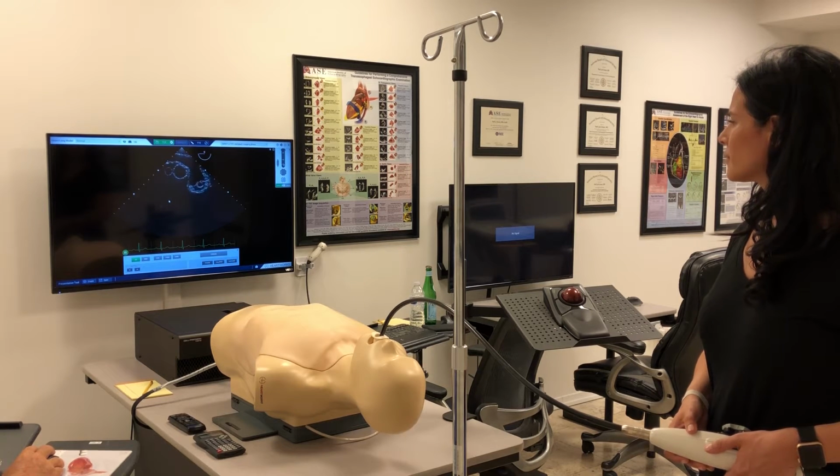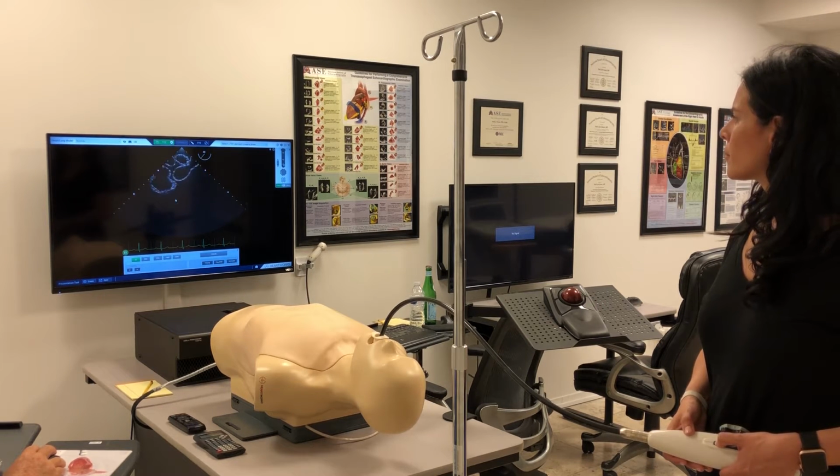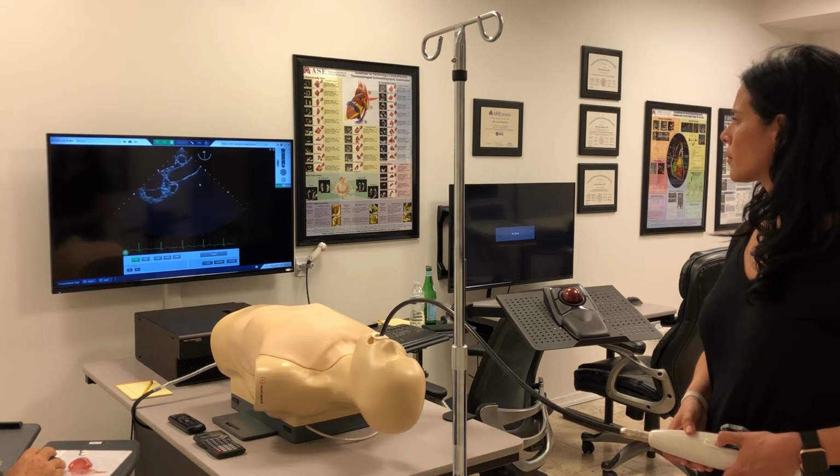Now, the next view is simply this view in long axis. If you've obtained the short axis view at zero, you know that the long axis is going to be at 90 degrees of omniplane because it will always be orthogonal to the short axis view. Beautiful. Good. Here's the ascending aorta long axis view, and this is, again, a mid-esophageal view.